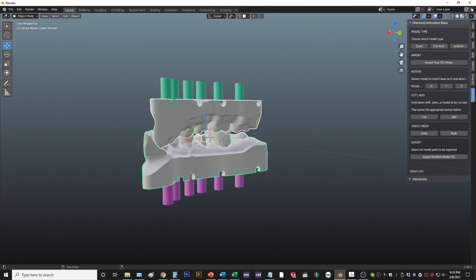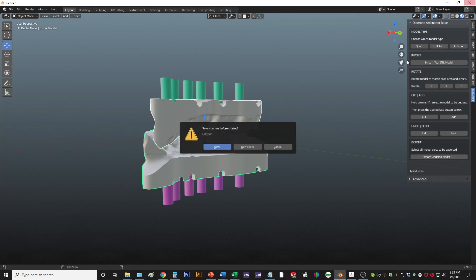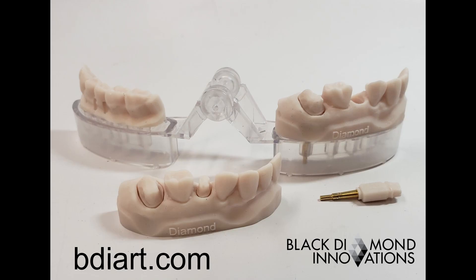Just close it out. You can go to bdiart.com to download your free software with any purchase.